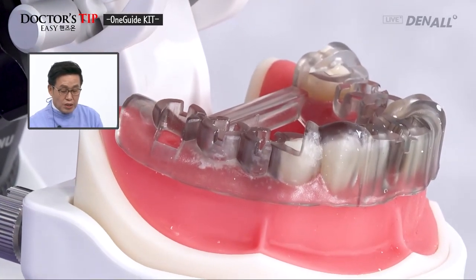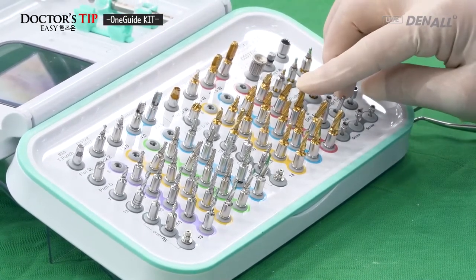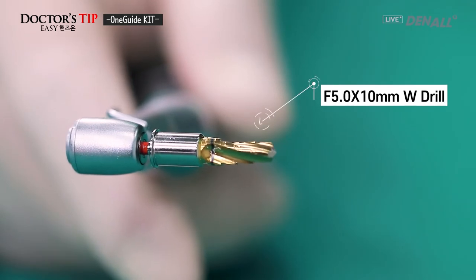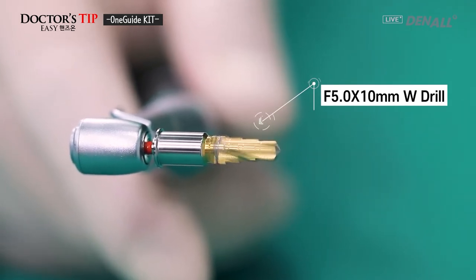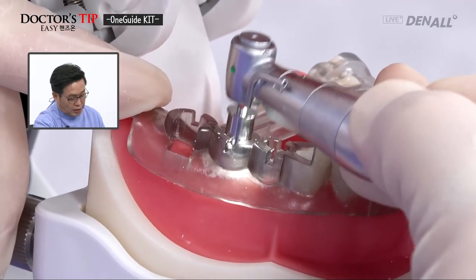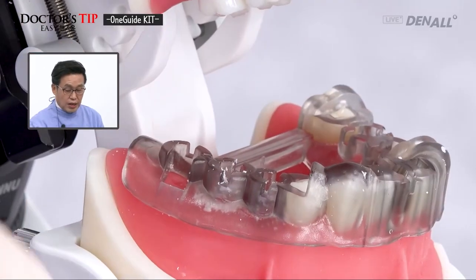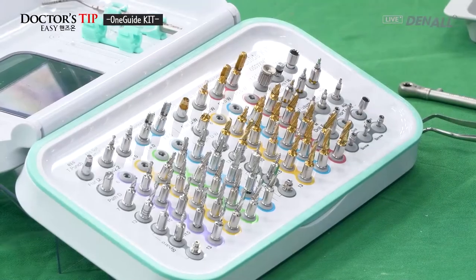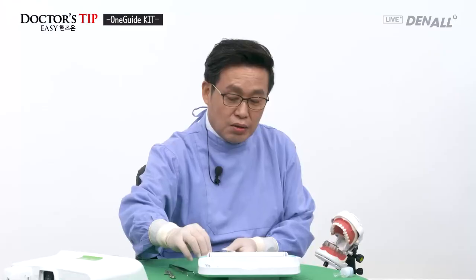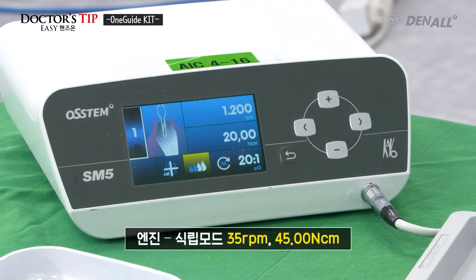The 3.5 by 10 millimeter drilling is done, and final drilling is going to be done. The 5.0 by 10 millimeter drill is going to be chosen with the wide barrel. This is the same. I'm going to put it on, and in contact, I'm going to drill in full length. An up and down motion is done to minimize heat generation. I'm going to drill full length. Drilling is now complete. For the no mount driver, there are regular and wide options. I'm going to choose the wide one and connect it. I'm going to change from drilling mode to placement mode.